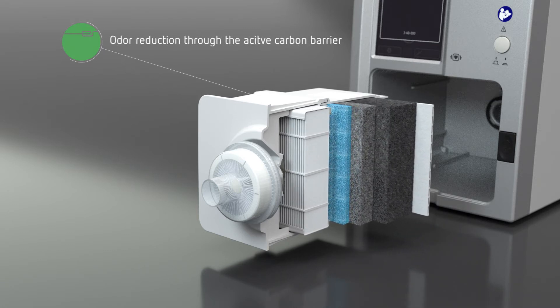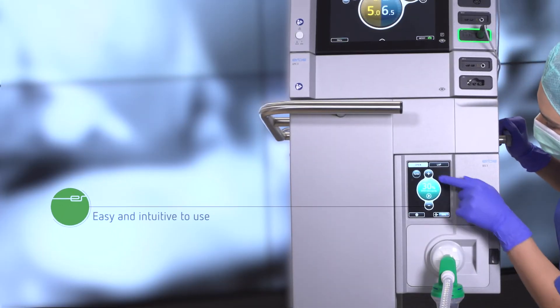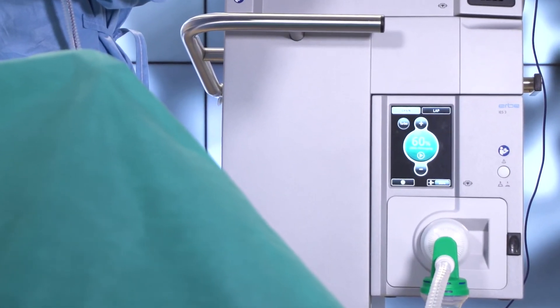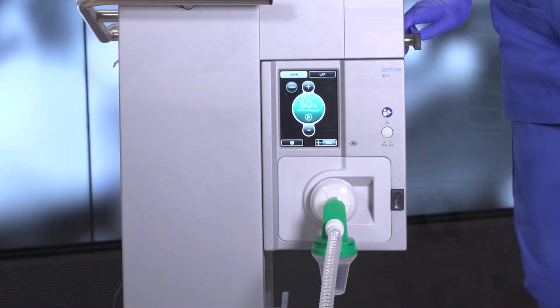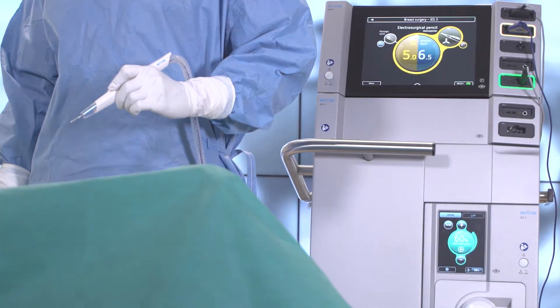The active carbon barrier reduces unpleasant odors that occur during cutting and coagulation. Operating the IES-3 is easy and intuitive. The remaining filter capacity, as well as all other parameters and instructions for use, are clearly shown on the display. The design of the touch screen is based on the proven VIO-3 user interface.